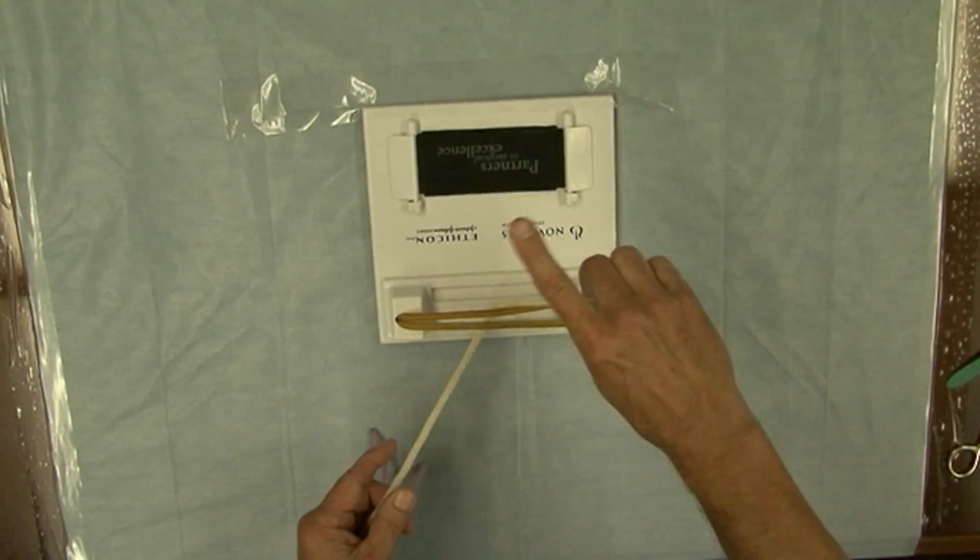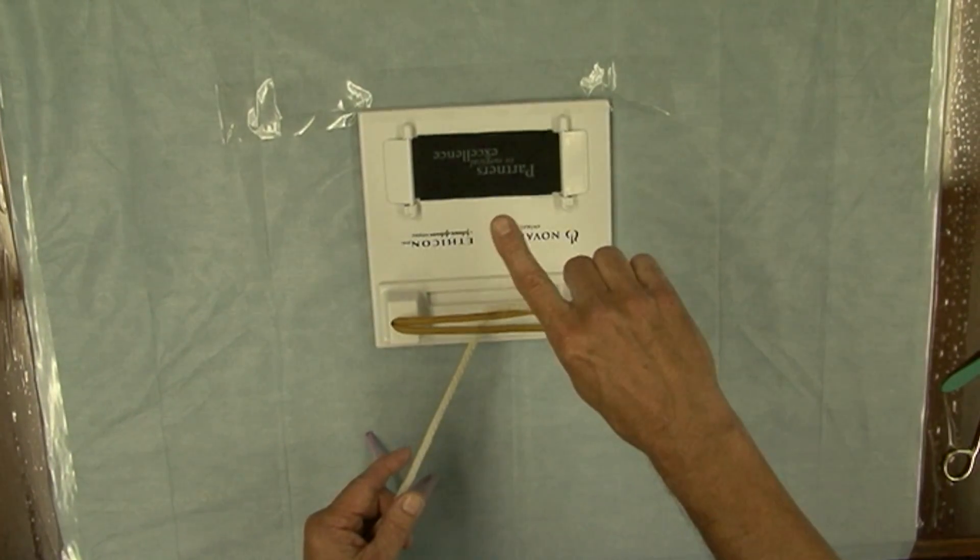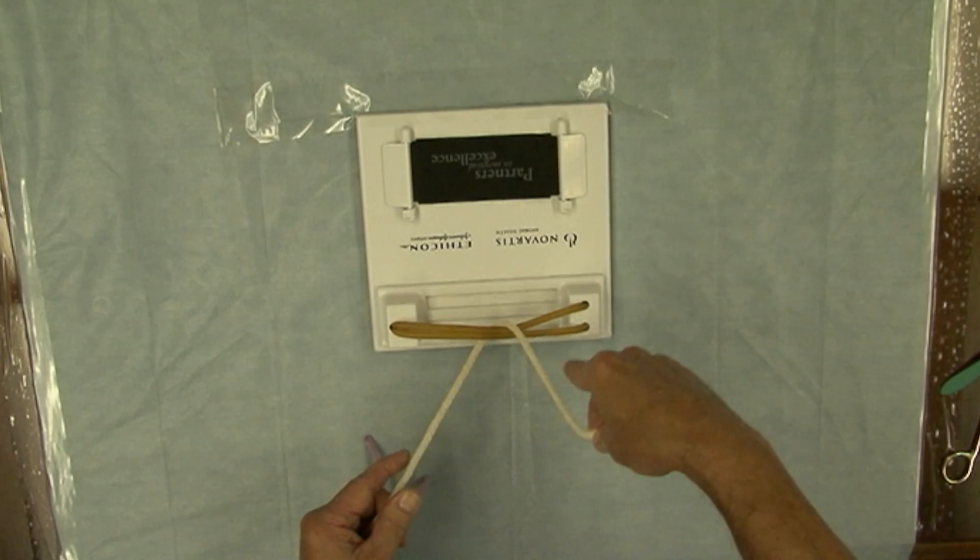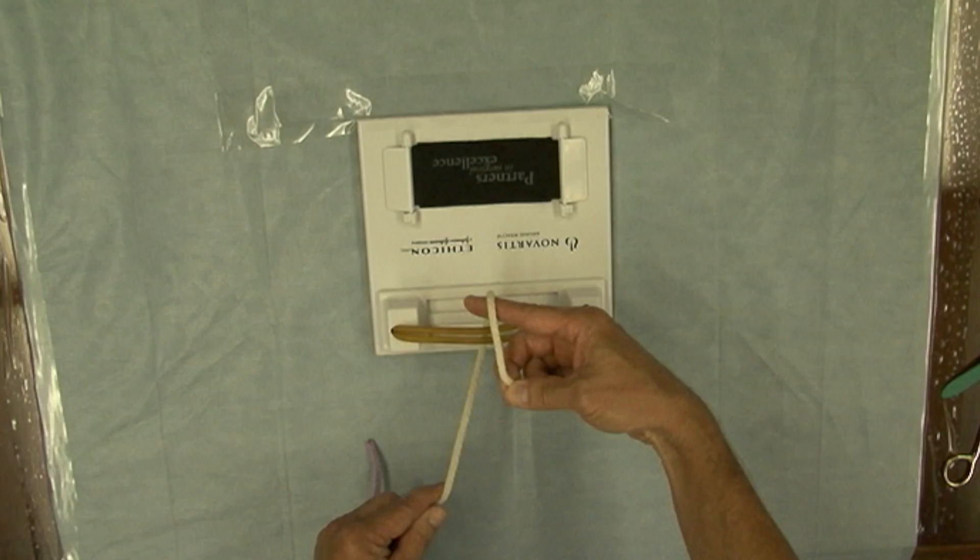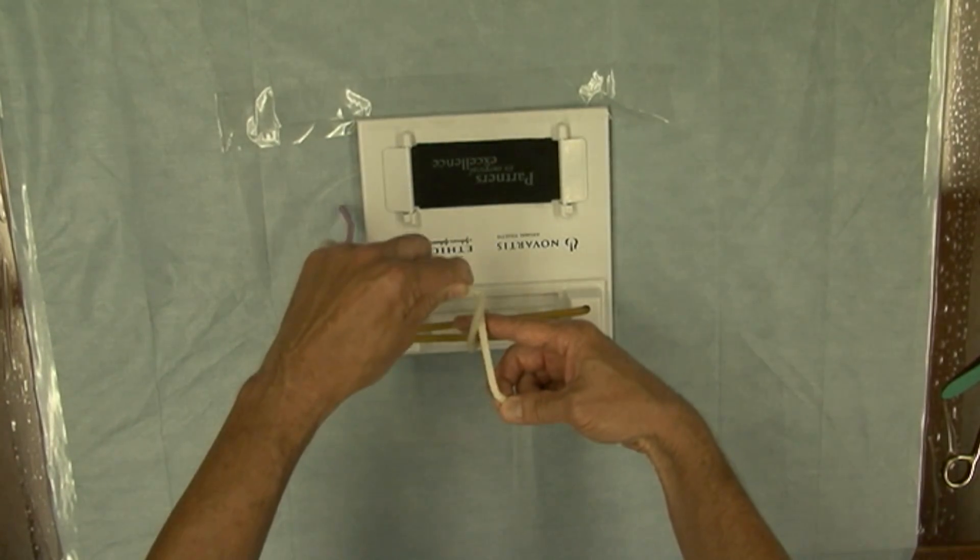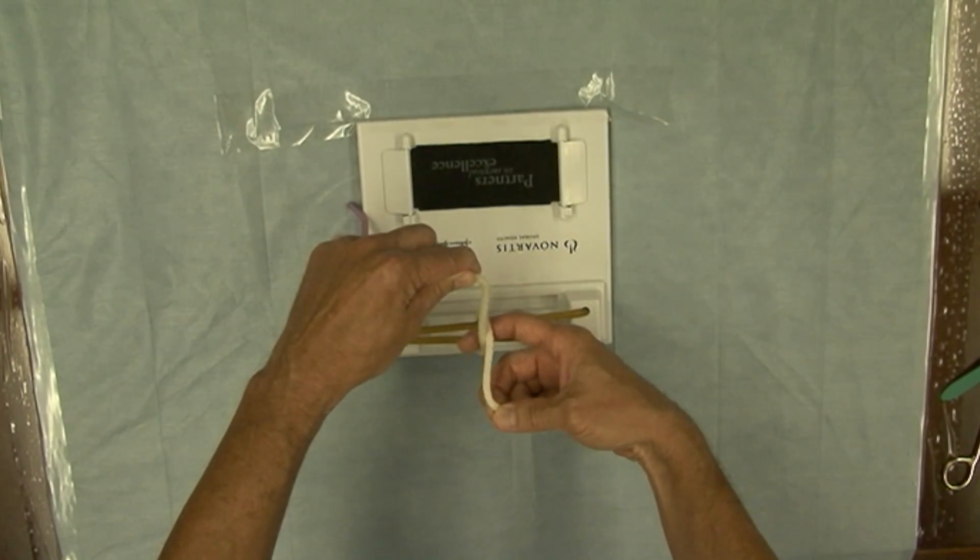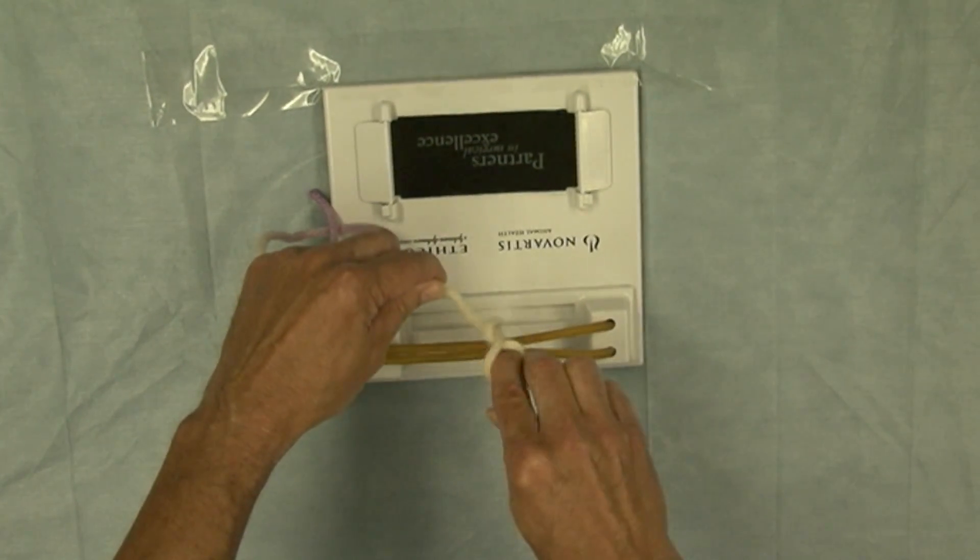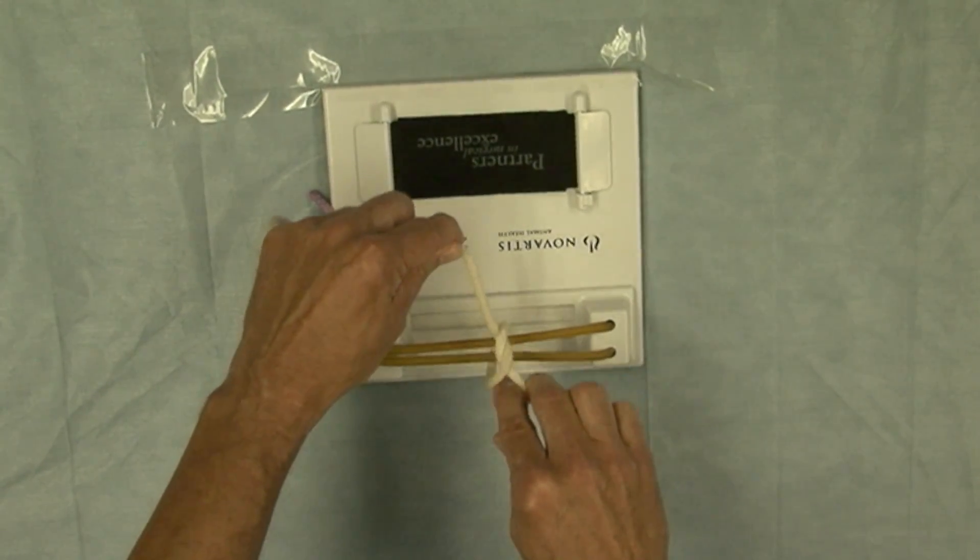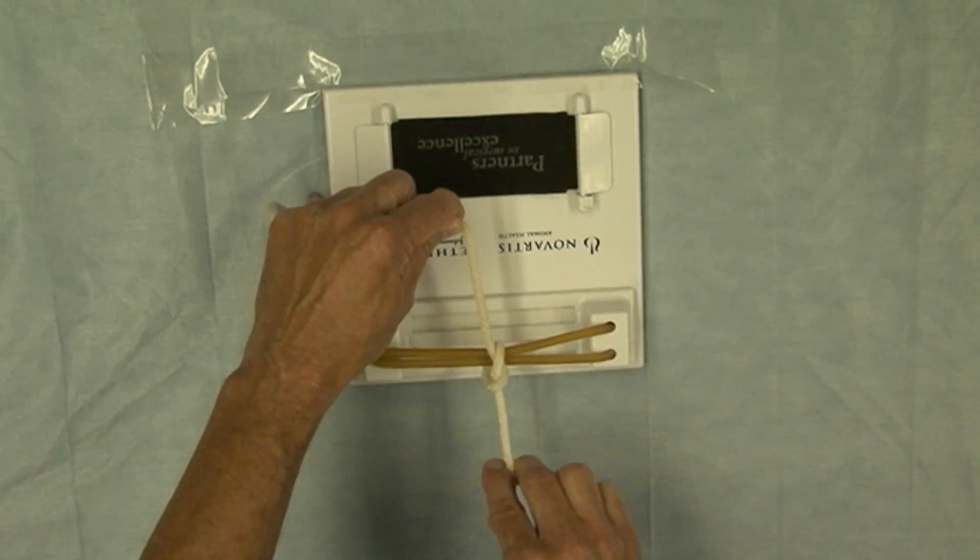So the first throw is I'm going to take my index finger, deliberately come around the suture like this, so that's a half a loop. I'm going to complete the loop and then I'm going to use my index finger to come underneath, trap, and bring the short end of the suture toward me.